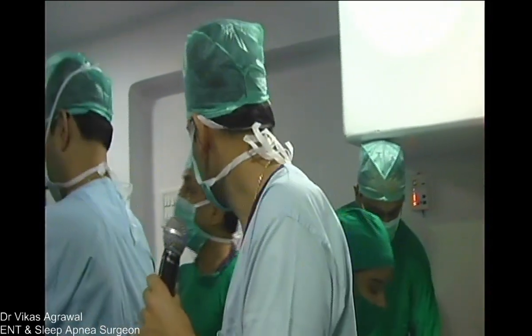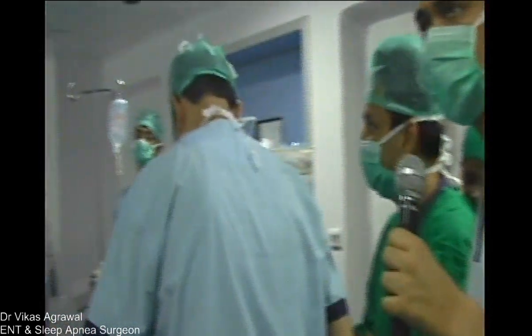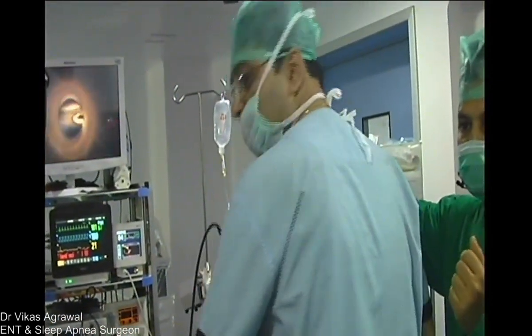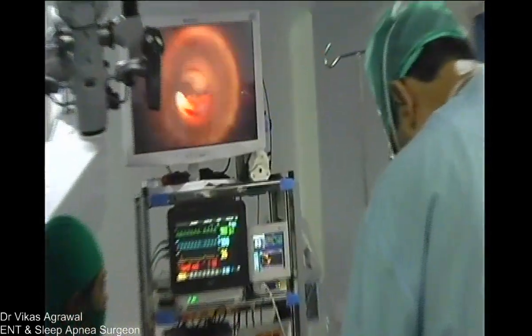Rahul, at this point of time, we'd like to show the intubation live, and we are using a video laryngoscope now. You have to only show this external camera. Just show this. Just focus on the screen.